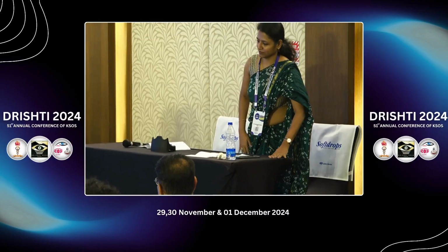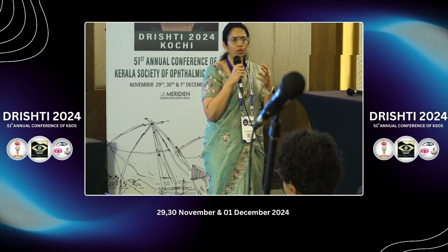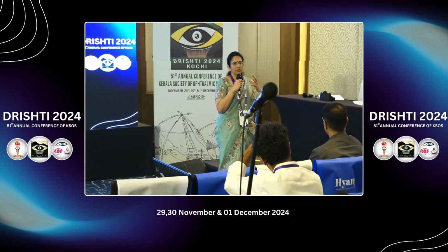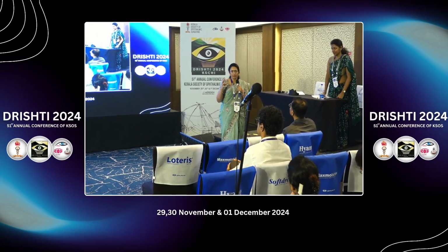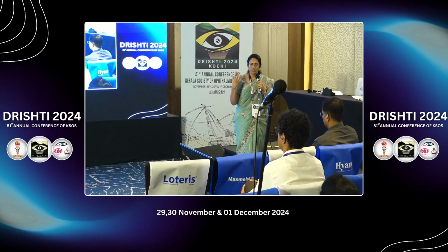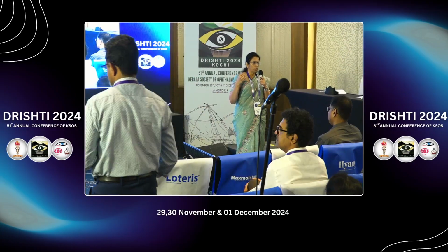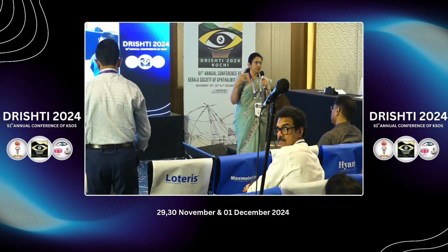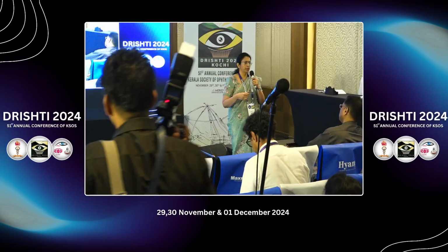In high myopes, it's better to use low IOP. Not only in high myopes, it's generally better to use low IOP settings, because the turbulence within the anterior chamber will be less, and so the corneal clarity will be more. The pieces won't fly away and chamber stability will be there. Especially in these high-risk patients, where you want to slow down things and you don't want chamber fluctuation, like high myopes and posterior polar cataract, it is safer to operate under low IOP.